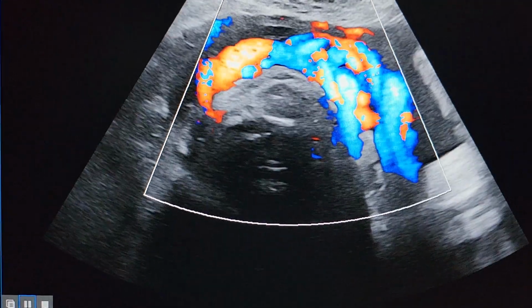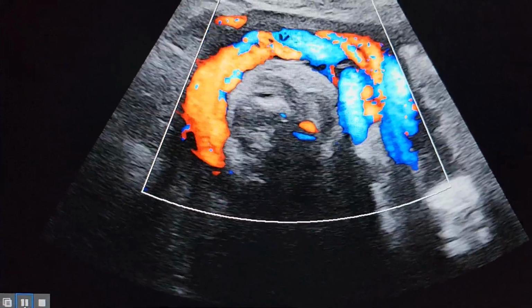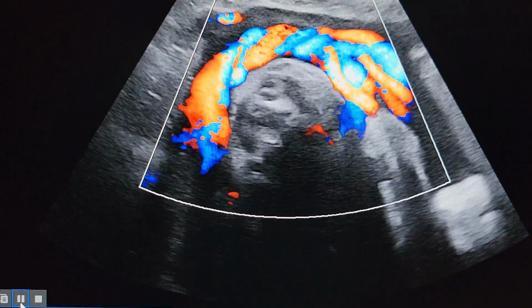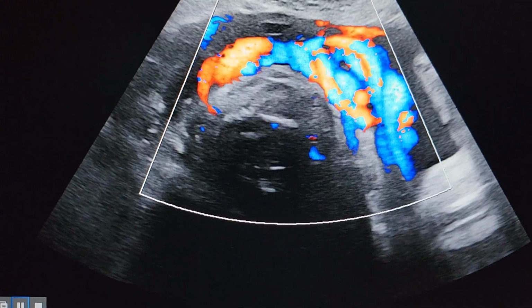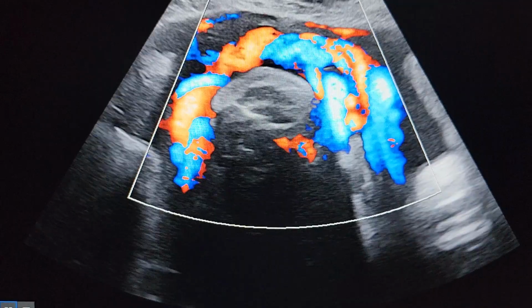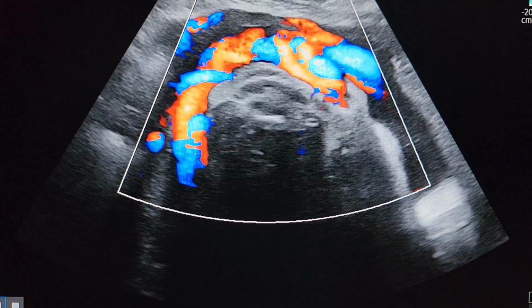This is usually possible in a smaller fetus or if the spine is at 3 o'clock or 9 o'clock position. But having shown it in sagittal and in axial for about 260 or 270 degrees of circumference of the neck, with two loops closely opposed to the neck of the fetus, this can be considered unequivocally as two loops of tight nuchal cord.